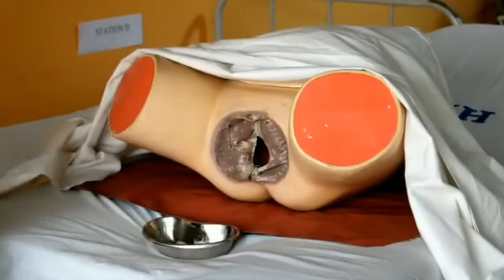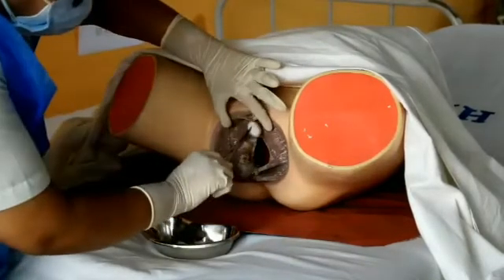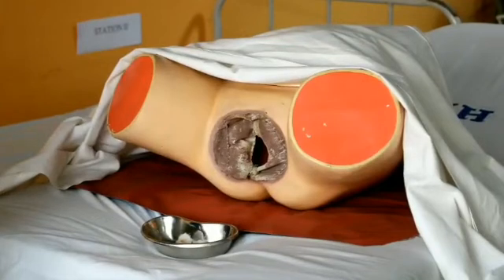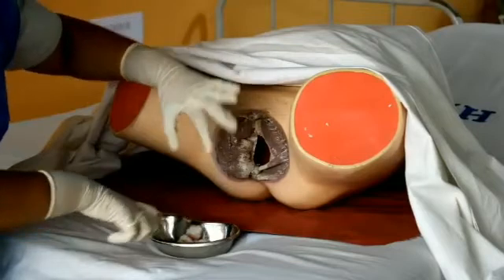Discard the cotton. Separate the labia minora with the non-dominant hand and with one stroke clean the labia minora of one side, discard, and with another cotton-soaked swab we have to clean the other side of the labia minora.